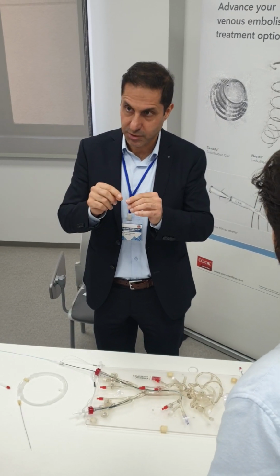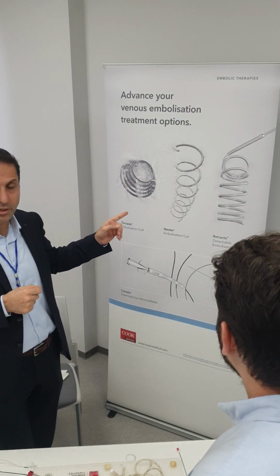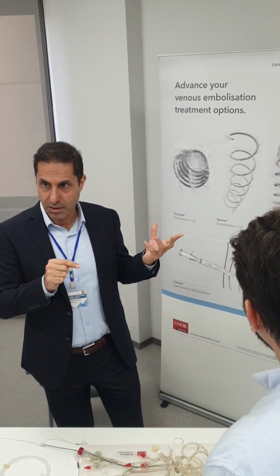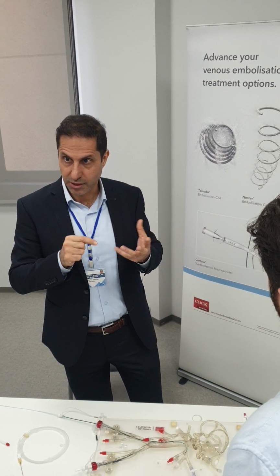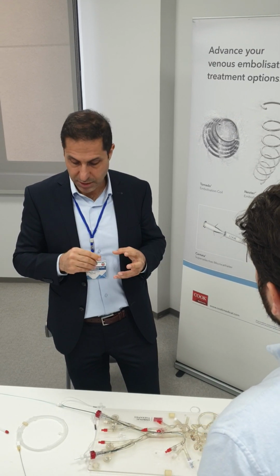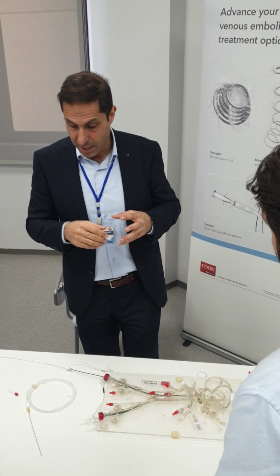So we have fibered coils like these coils from Cook. We have microfibers on them. The function there, they are thrombogenic. They will catch platelets and it will form a clot easier, and they will occlude the vessel easier and sooner.